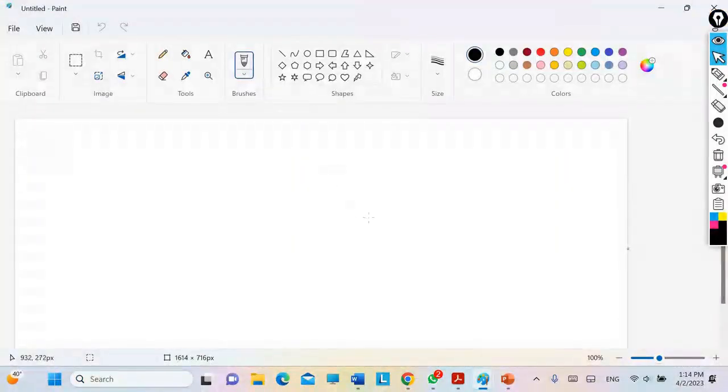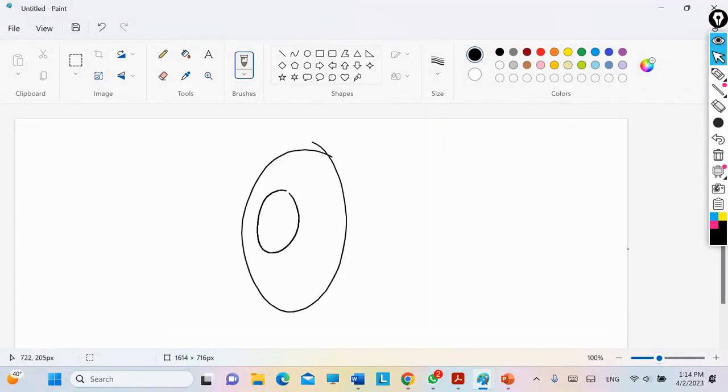So, I currently have this brain, and I have a tumor, and I want to measure the metabolites present in this area. Am I treating this image as 2D or 3D? Are you working with it in the X plane or in the XYZ plane, or X and Y?